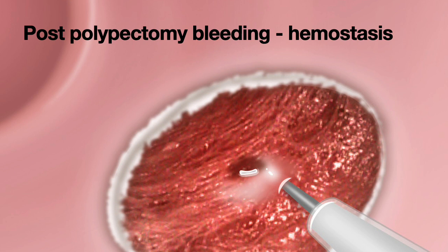Whether it is peptic ulcer bleeding, diverticular bleeding, or post polypectomy bleeding, it is important to keep in mind that epinephrine injection slows down the bleeding. Maybe in some cases it can arrest the bleeding, but you have to make sure that you apply additional hemostatic measures, either application of a clip or using a thermal device to seal the blood vessel. Without that, the patient is going to rebleed. We don't want that.